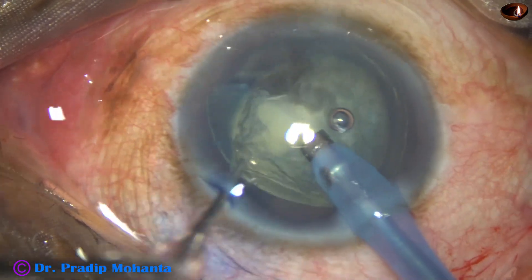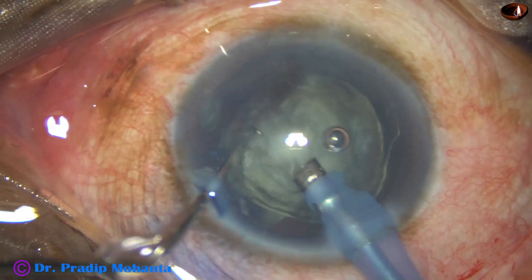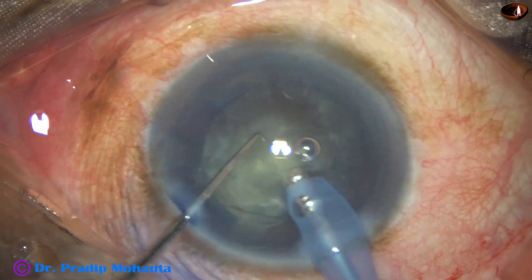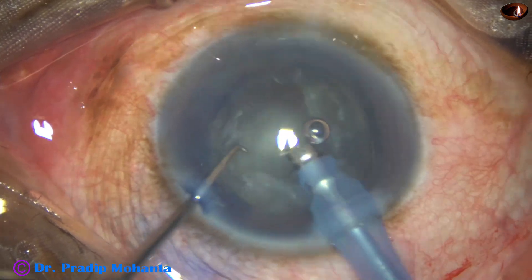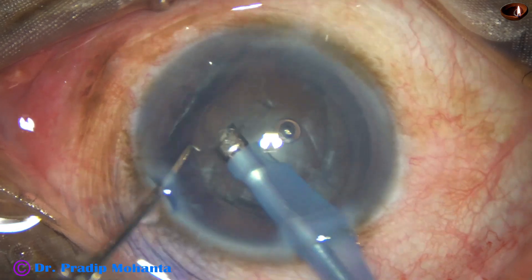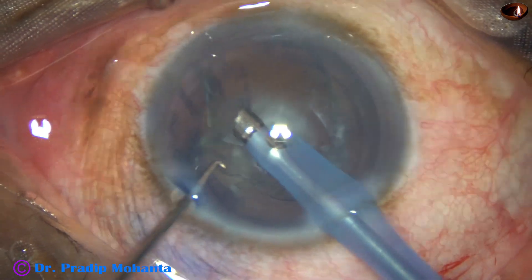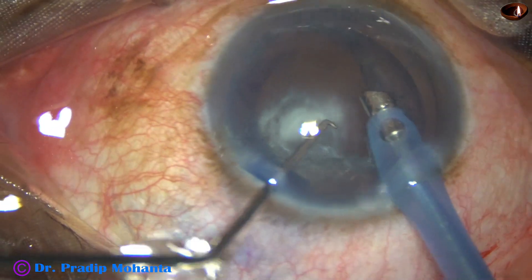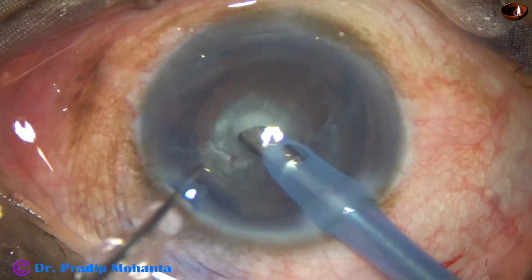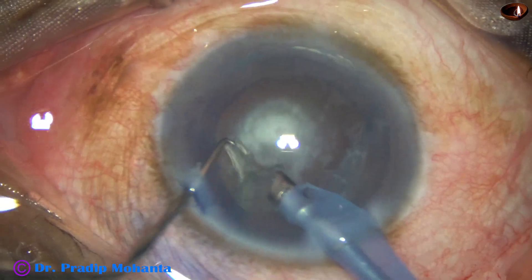By this time the nucleus is mobile. A thick shell of lens mass — an epinuclear shell — is protecting the posterior capsule. Even if posterior capsule rupture occurs, some soft lens matter will drop into the vitreous cavity, which is easy to remove with a vitrectomy cutter. But if a nuclear piece drops, it is very difficult to manage — we may have to use a fragmatome or ultrasonic energy in the vitreous cavity. Soft epinuclear matter, if it drops, we can easily manage.